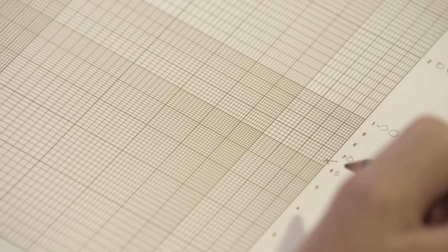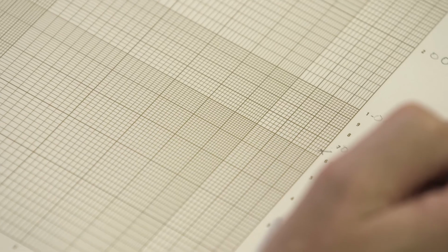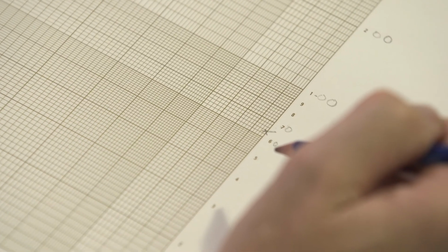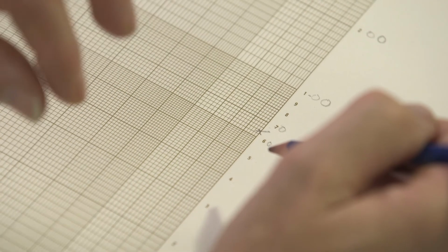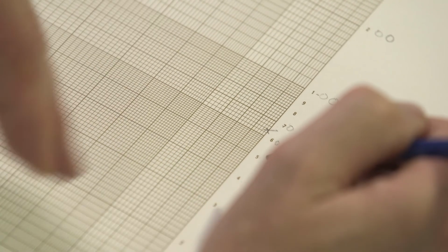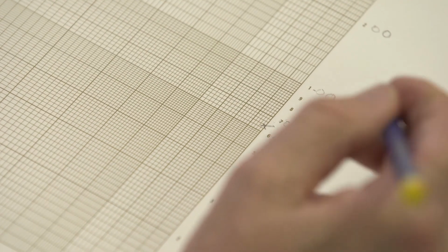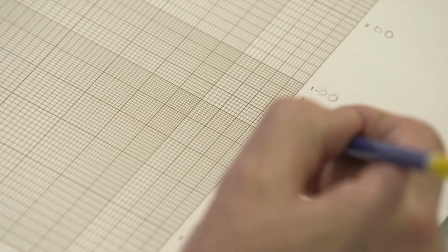It's a very narrow scale, and this is a problem with manual calculations in this way. We can introduce some variability. If several people take the same clotting times to the graph paper, there is some variability in the way the figures are interpreted. So we have to keep that in mind as a source of variability. 63.5. Now we need the clotting times for the second dilution.